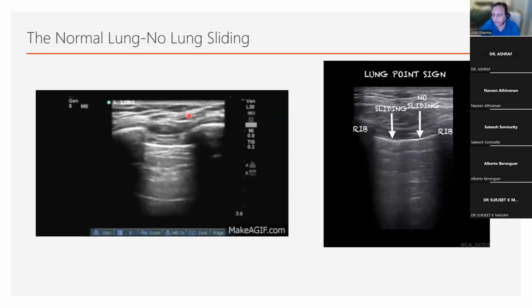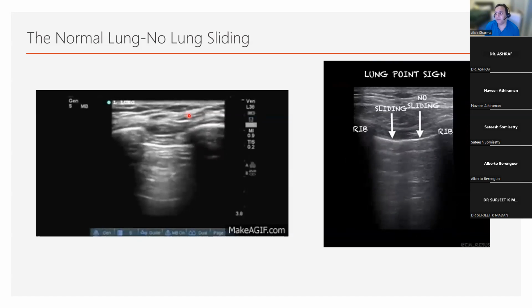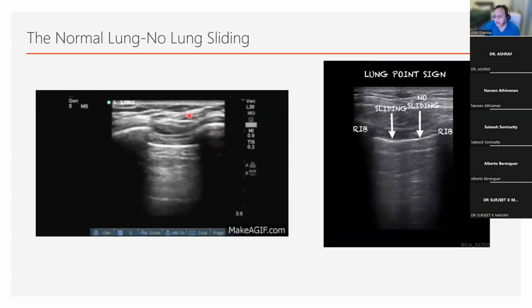Really, really important. I'm just giving you a feel for a baby with a pneumothorax who, in our setup a few years back where I was working, had a chylothorax which was drained multiple times. We ended up extubating the baby after starting octreotide and removing the chest drains.